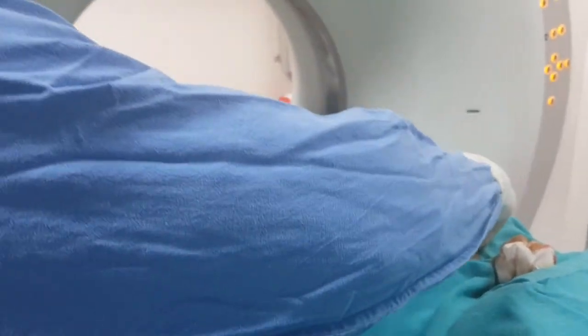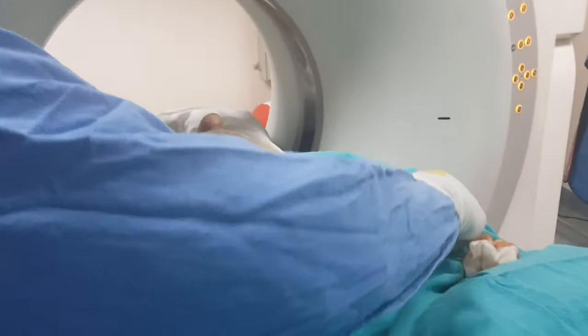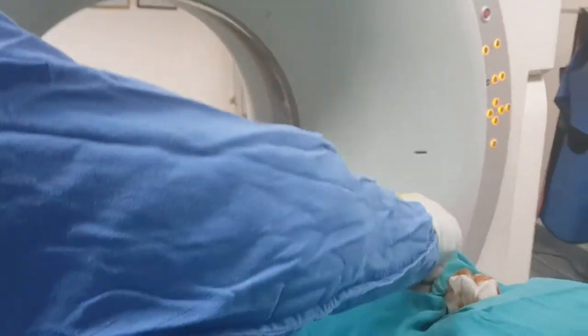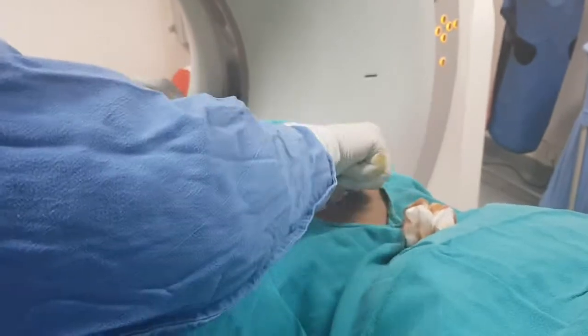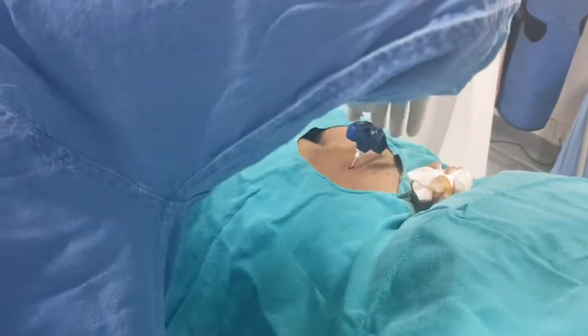The table of sacrum — it goes very quickly. I was surprised; I was thinking that it slipped, but it had not. Most of the bone has been negotiated.